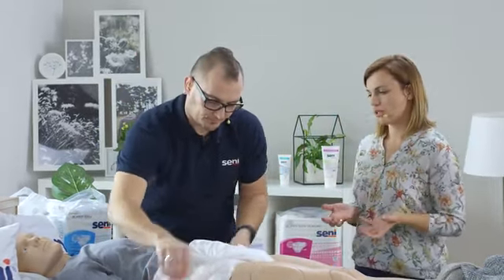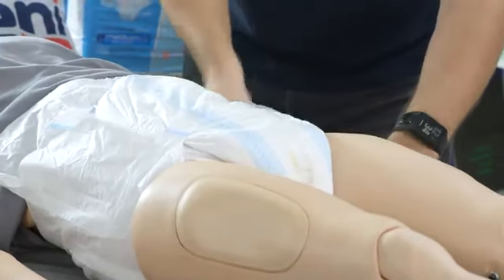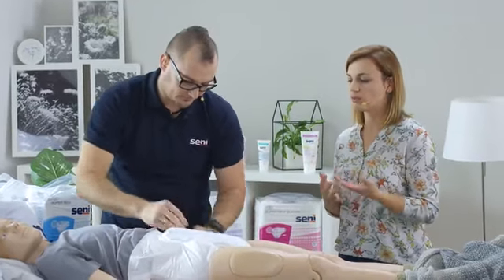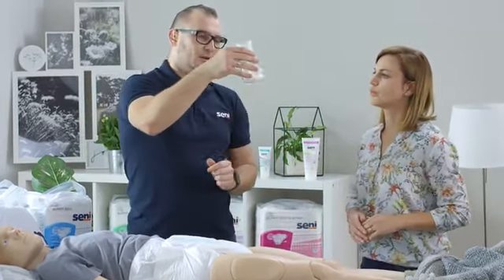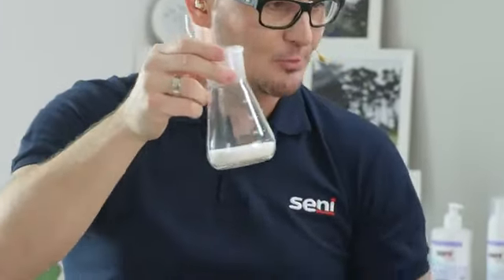Well, when facing the issue of urinary incontinence, unpleasant urine smell becomes a big problem. How can you deal with this unpleasant smell? Do the products contain any element that prevents this smell? They have, and here it is. It is the powder. Sugar? No, it's not. It's very similar to sugar, but it's super absorbent.